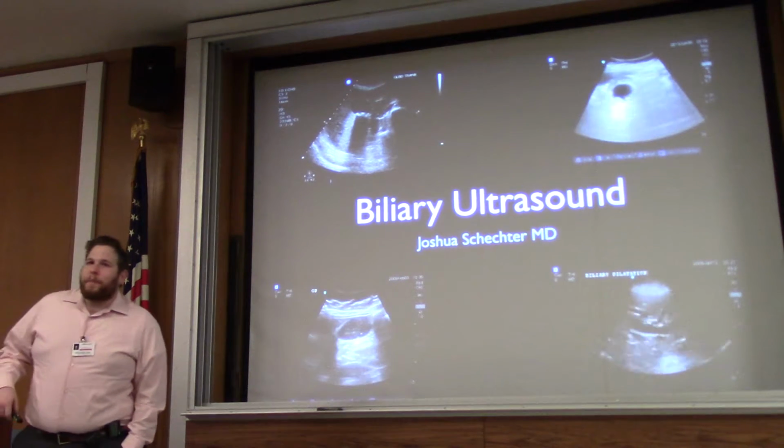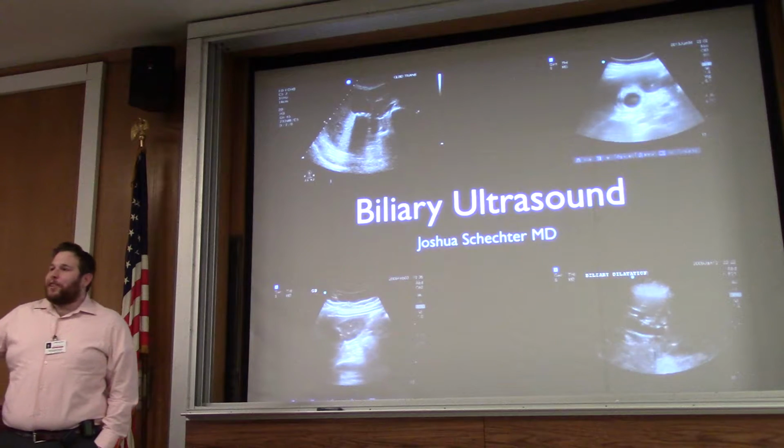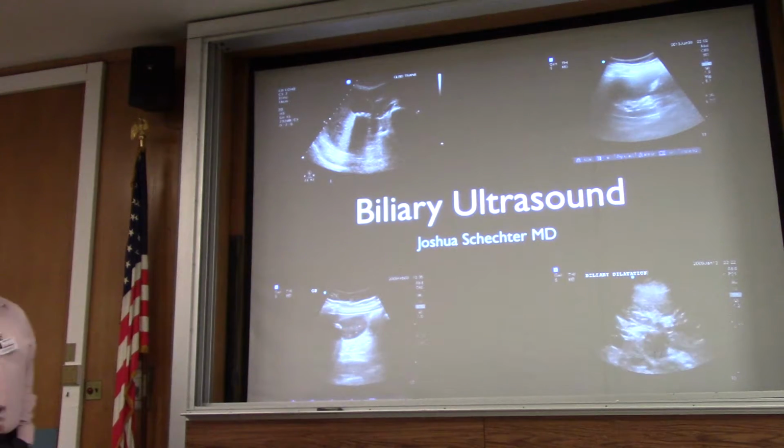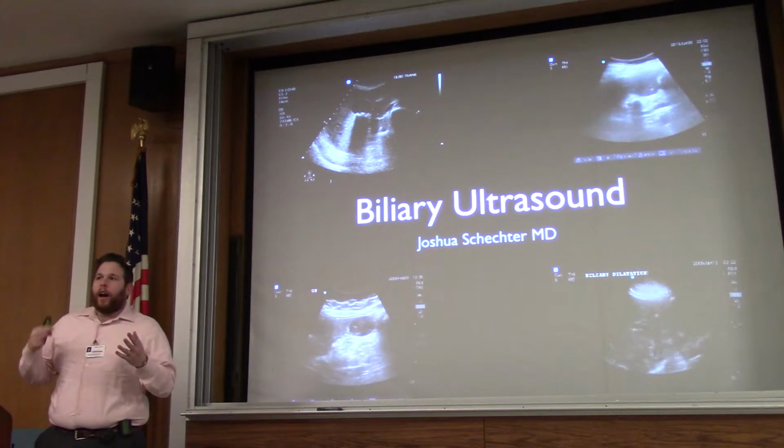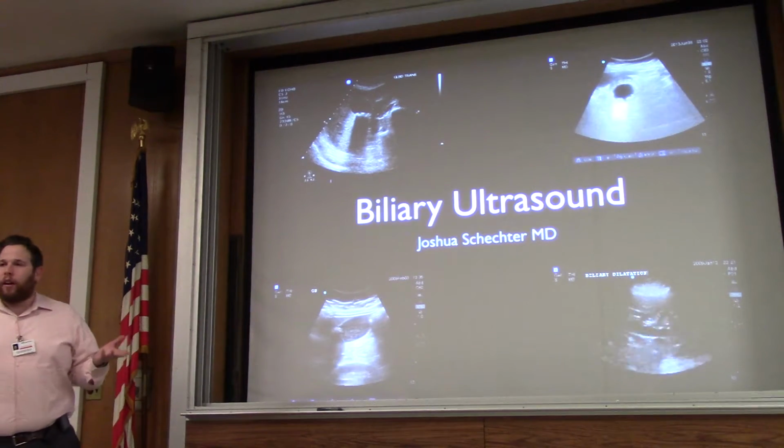So I know you guys are expecting Dr. Mehta, and I'm sorry if you're disappointed, but you're stuck with me. What I'm going to be talking about this morning is biliary ultrasound. I want to go over really the basics of gallbladder ultrasound.